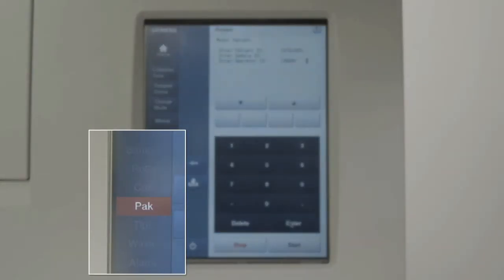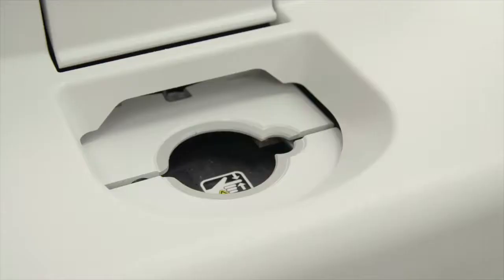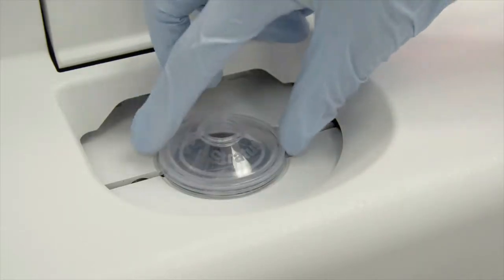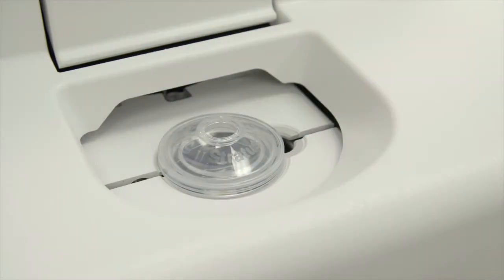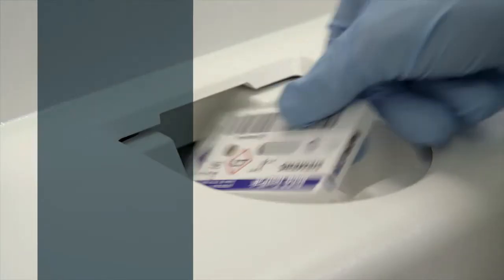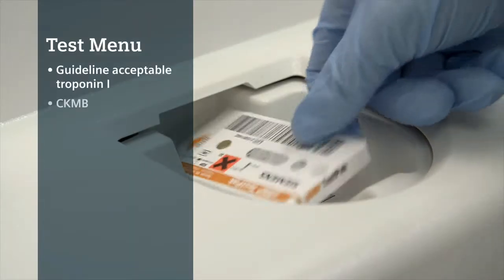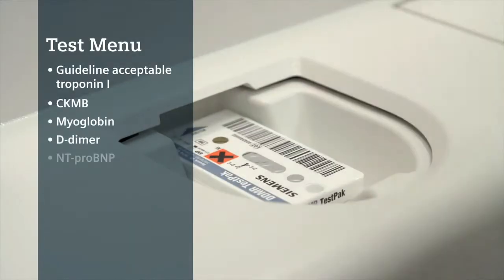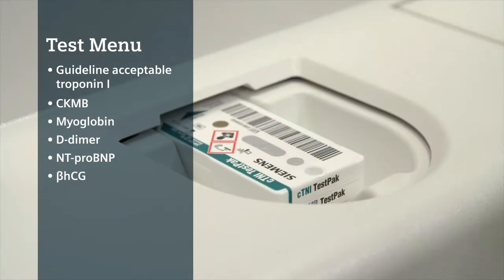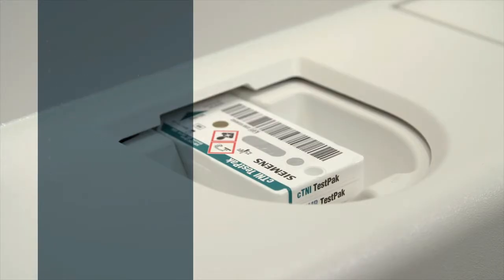The sample is now ready for processing. The sample is dispensed into the rotor and then centrifuged. You can customize testing by running any combination of up to 4 test packs on a single patient sample. Just insert the required test packs into the pack manager well.